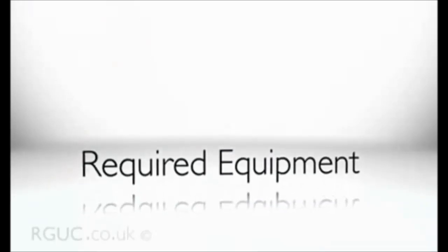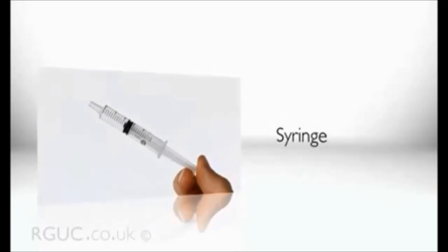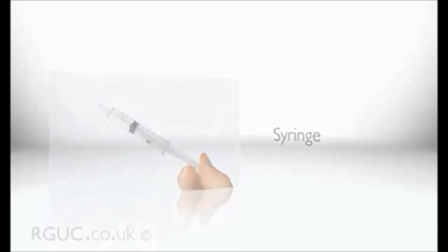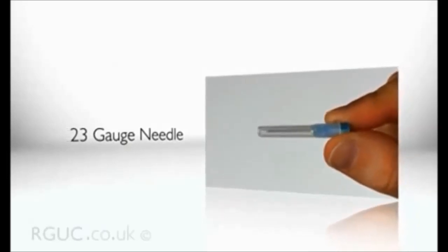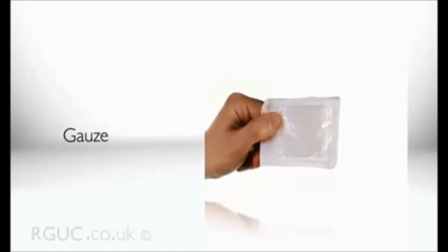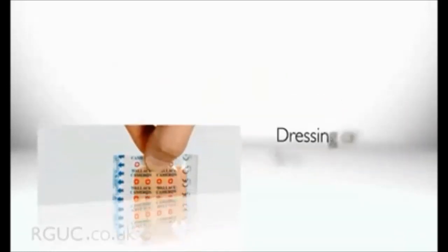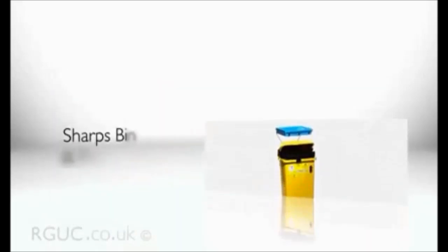To perform an intramuscular injection, you'll require the following equipment: a completed prescription, a syringe containing the prepared medication that has been checked, a 23-gauge needle. The length depends on the size of the patient. An alcohol-based cleansing wipe, gauze, a suitable dressing or small plaster, and a sharps bin and tray.